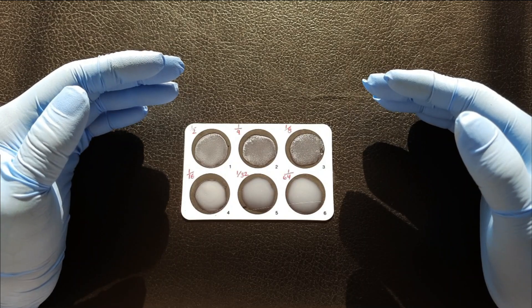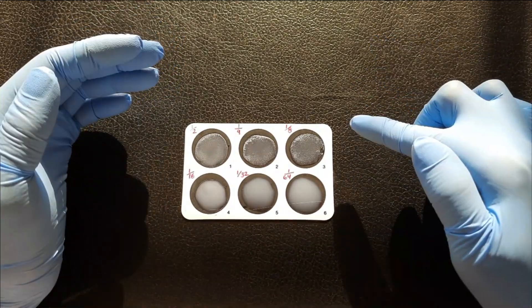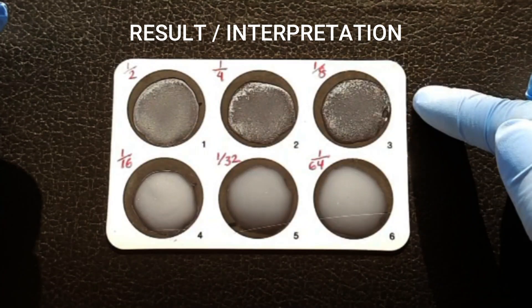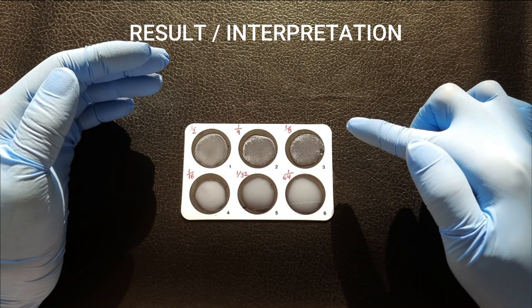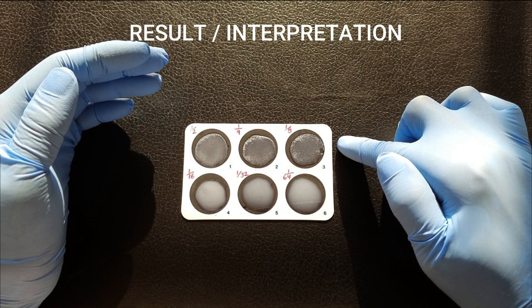Now, observe carefully for agglutination in each circle. Notice, agglutination has occurred up to circle 3. So, 1 in 8 is found the highest diluted serum up to which the agglutination is observed.